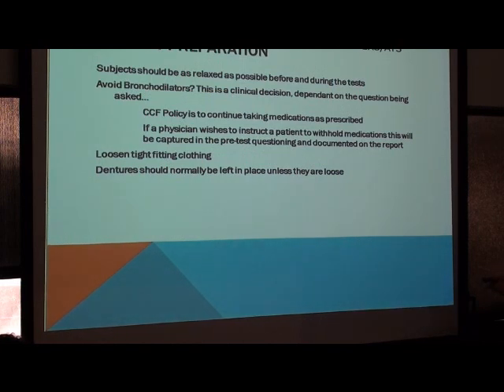So right now, the test really isn't being used as much to assess a bronchodilator response, but more to see how they're doing with the current regimen. Noting the last time they took their dose of such and such was this many hours before the test or immediately before the test, the question becomes, how are they doing on that? Is their bronchodilation medication optimized?